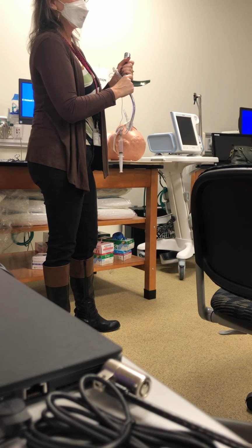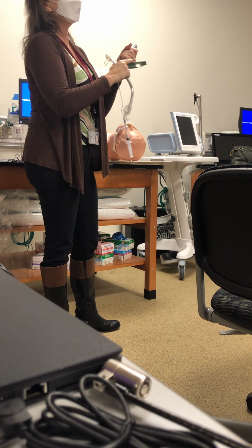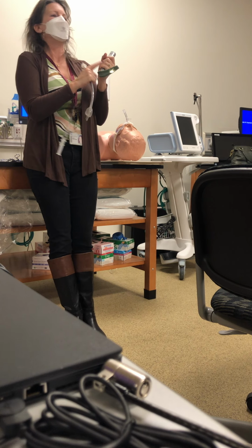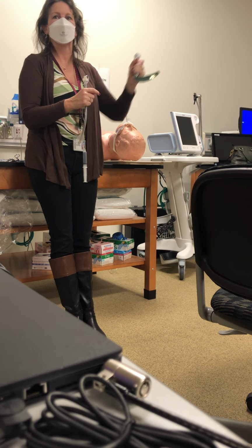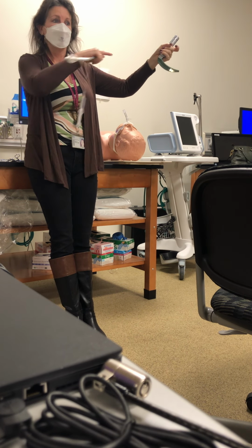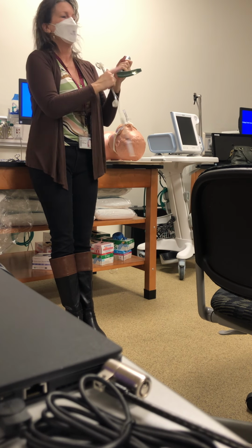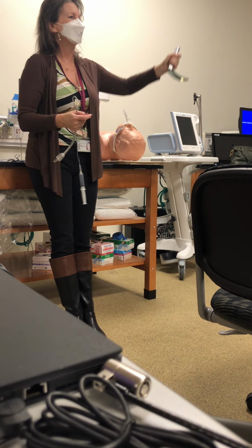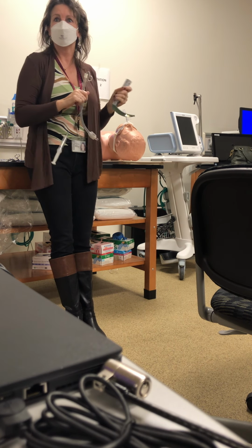Do you know where the vallecula is? The end of the tongue. It's the base of the tongue. So the Macintosh fits into the vallecula. This will be on your quiz. Macintosh fits into the vallecula and indirectly lifts the epiglottis. Because you're not lifting it, you're lifting the vallecula, which is the base of the tongue, and that lifts the epiglottis. So now the epiglottis is lifted and I can see my cords, okay?